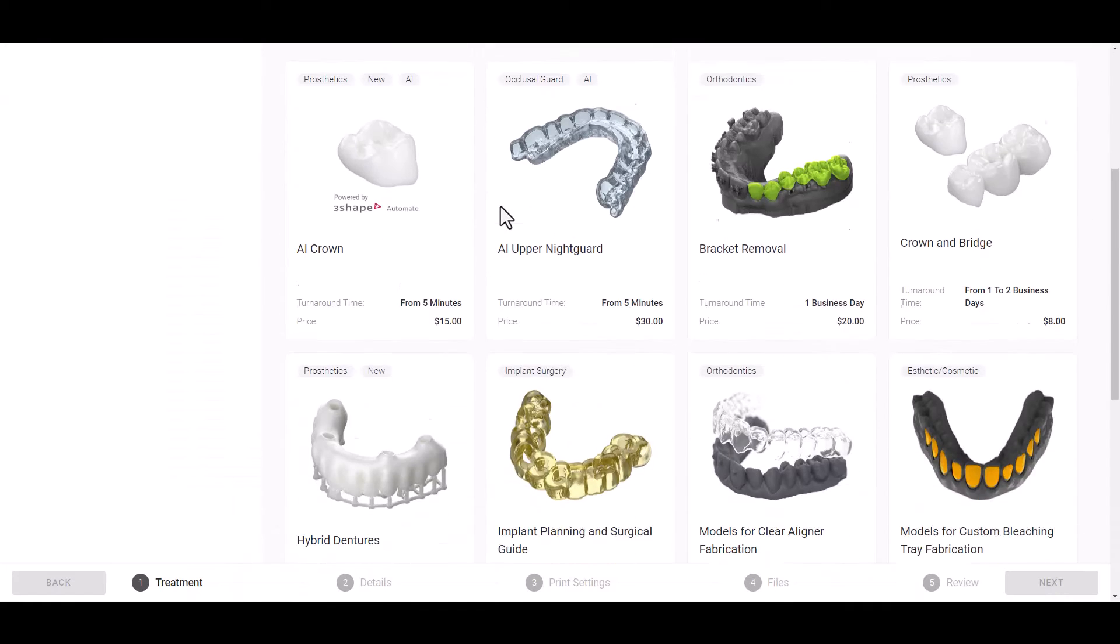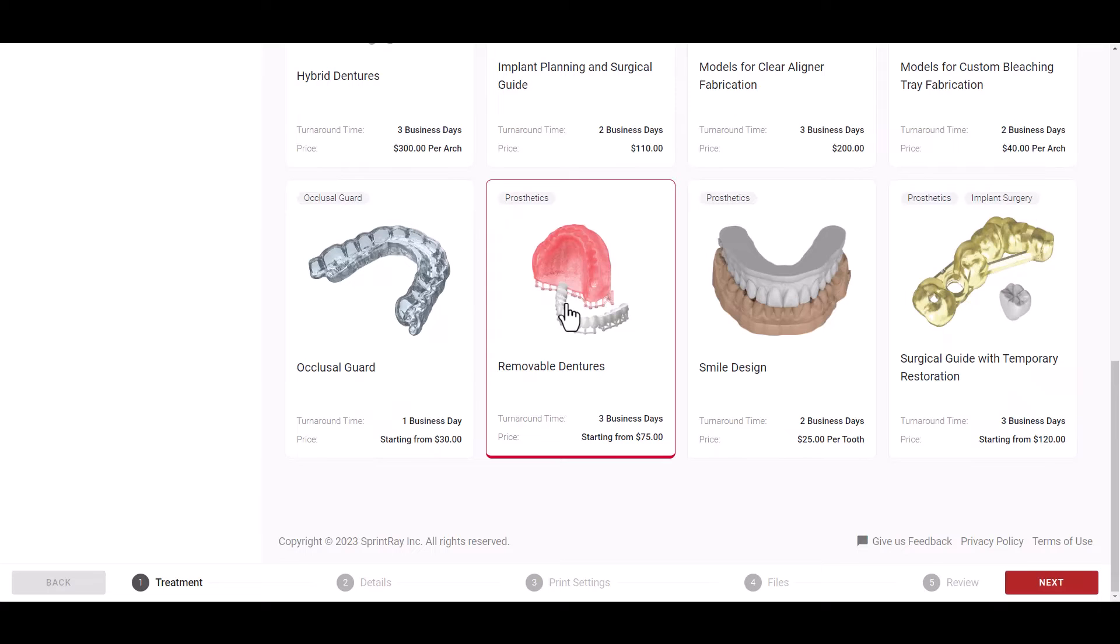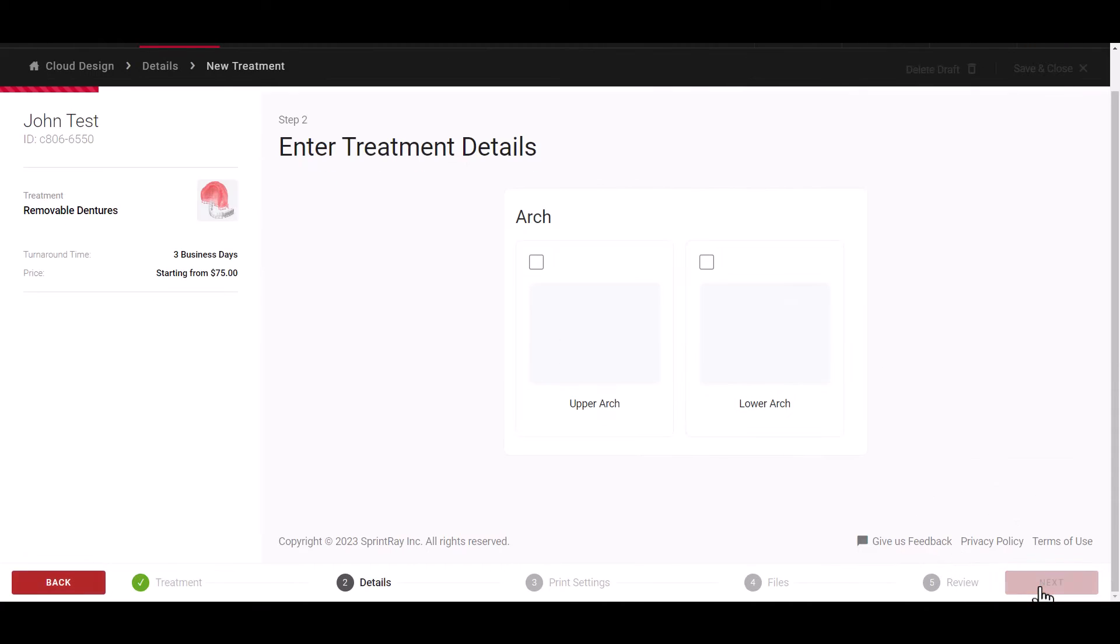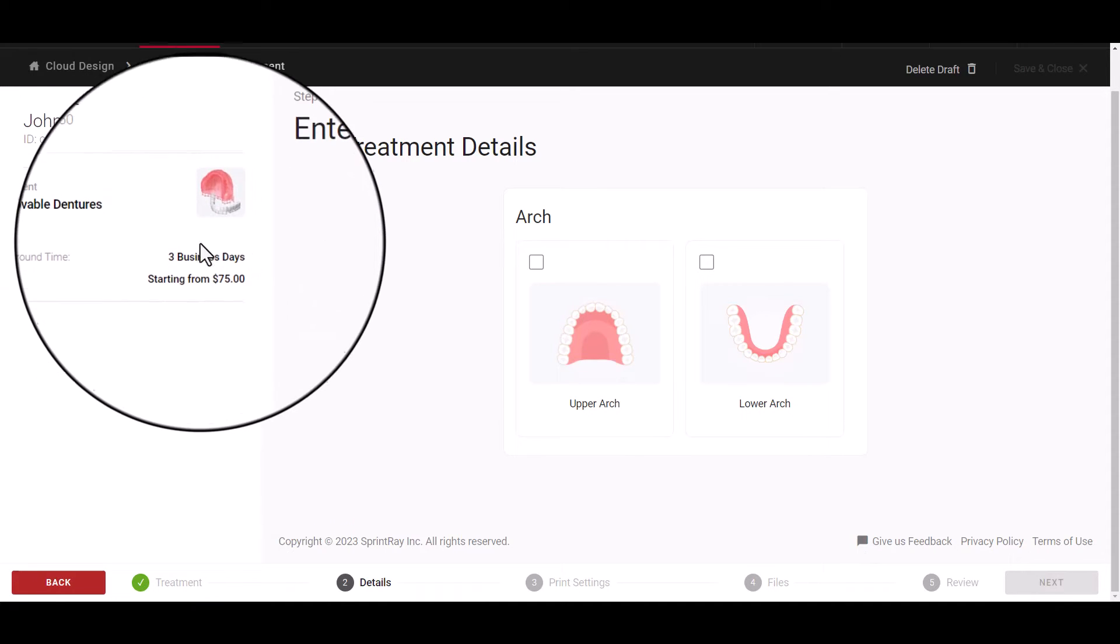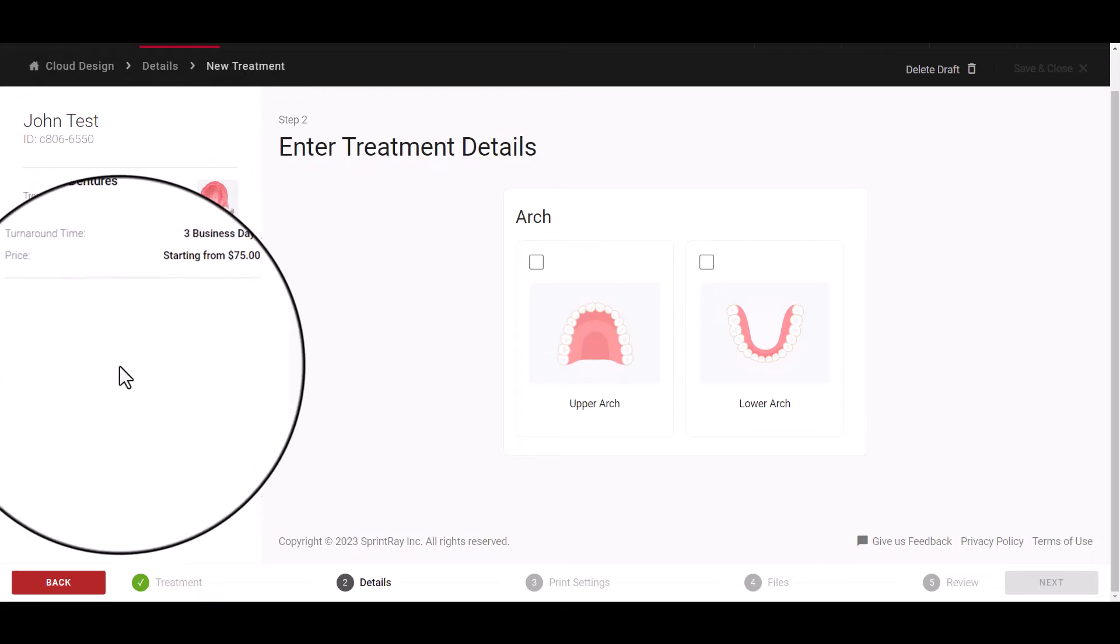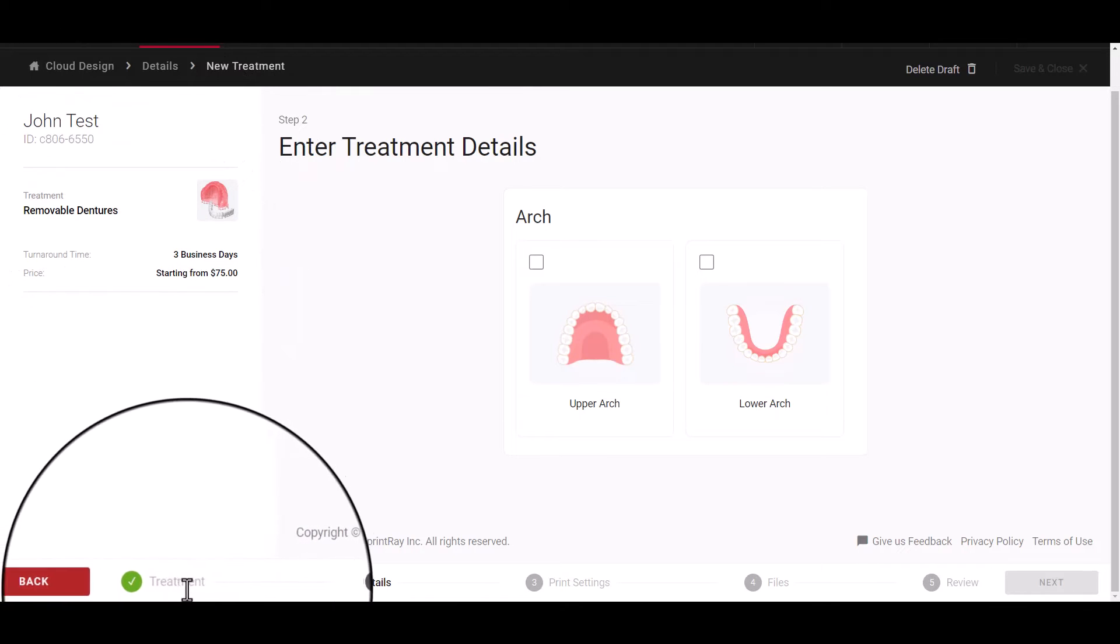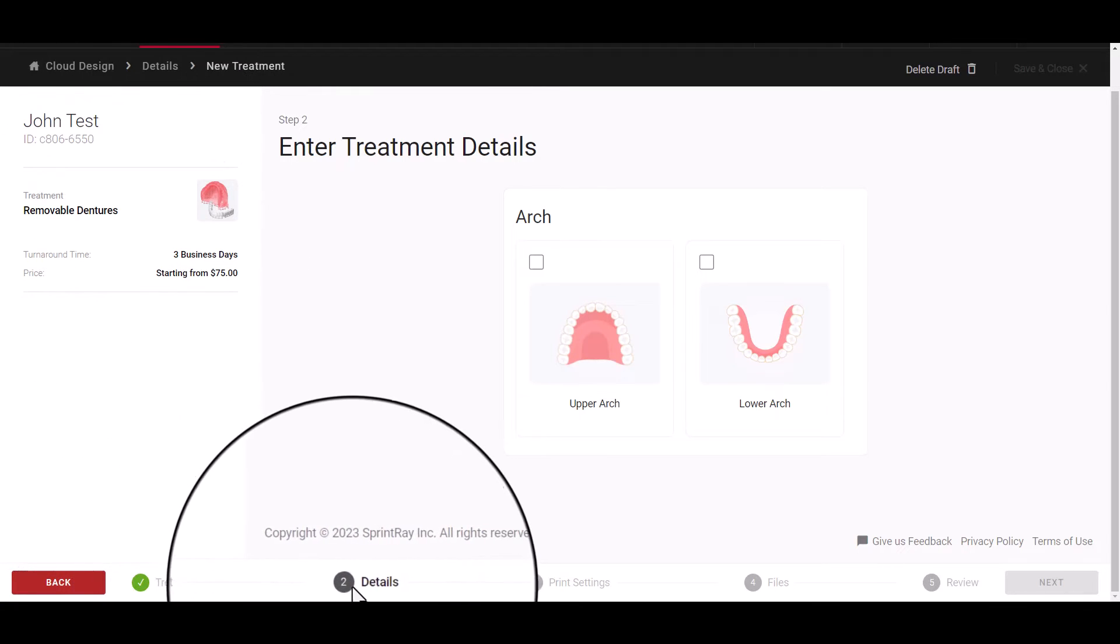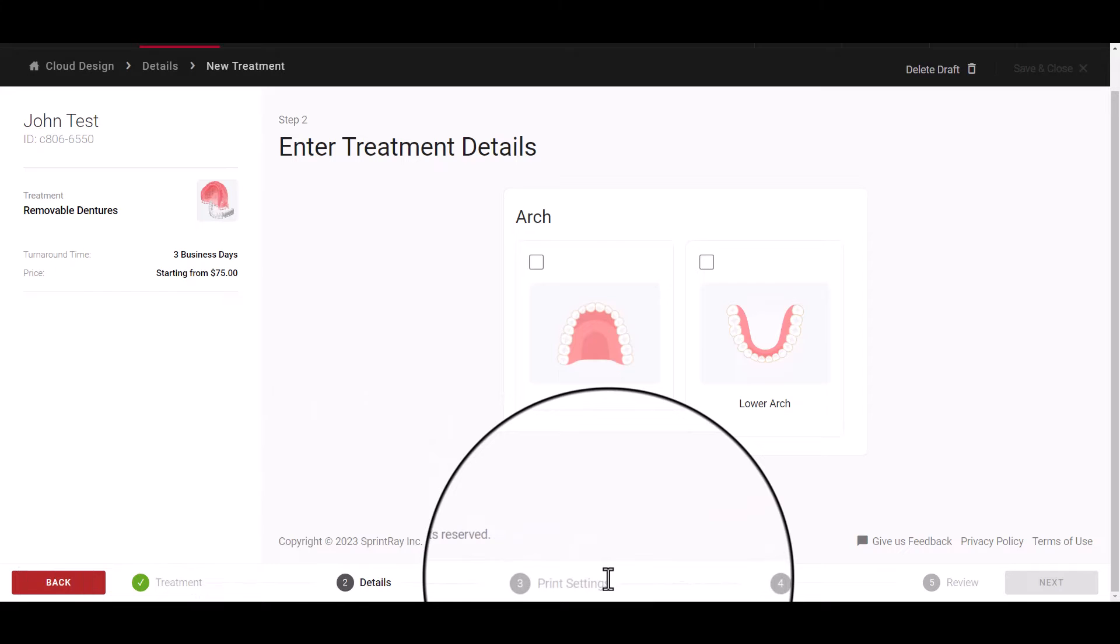After selecting a patient, choose the type of treatment you would like to submit to SprintRay cloud design and here you will see the biggest changes to the user interface. On the left-hand side you will see the current status of the treatment and along the bottom you will see the treatment stages tracked for each step along the process.